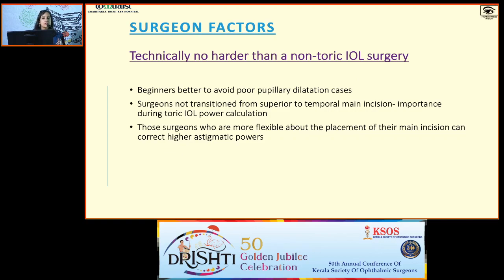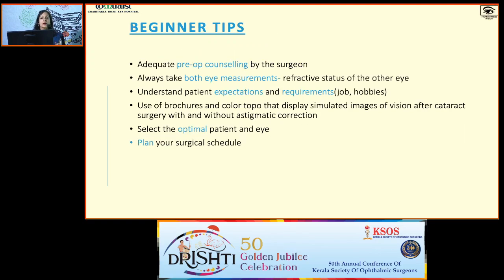Surgeon factors. Now, technically, toric IOL surgery is no harder than a non-toric IOL surgery. Like I suggested earlier, better to avoid certain conditions just until you find your feet in the surgical practice of toric IOL implantation. Beginner tips, of course, adequate pre-op counseling.